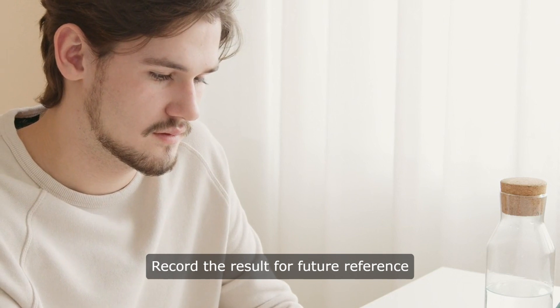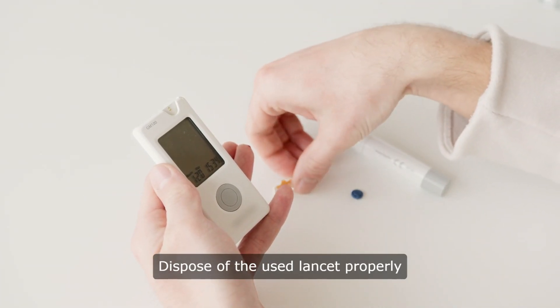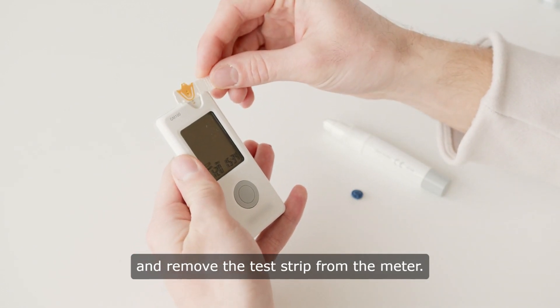Record the result for future reference in your diabetes logbook. Dispose of the used lancet properly and remove the test strip from the meter.